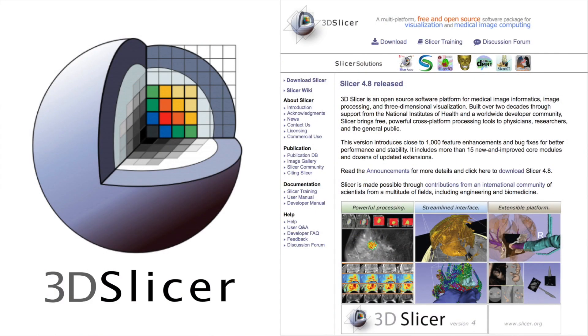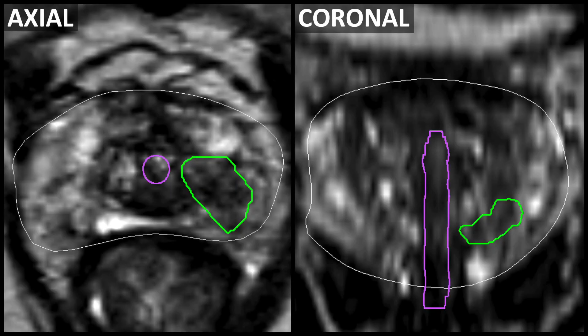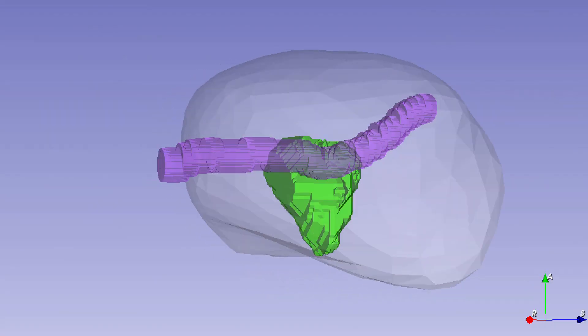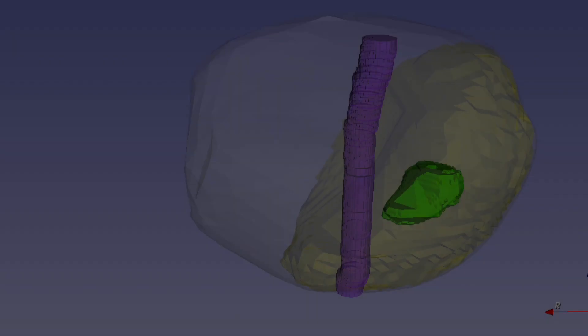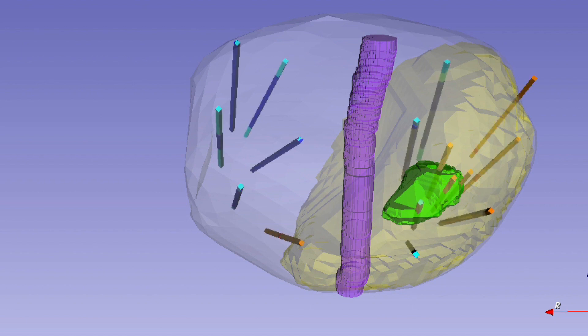We use the open source software 3D Slicer to visualize and better understand individual treatment plans. Here you can see our example patient's MRI and 3D prostate model. After the safety margin is applied, the recommended treatment volume is a pretty substantial portion of the prostate. However, we can further refine this model by registering the positive, shown in orange, and negative, shown in blue, tract biopsy cores.